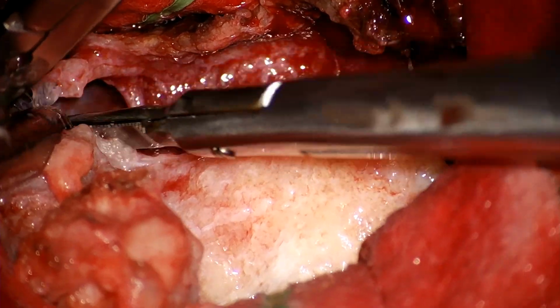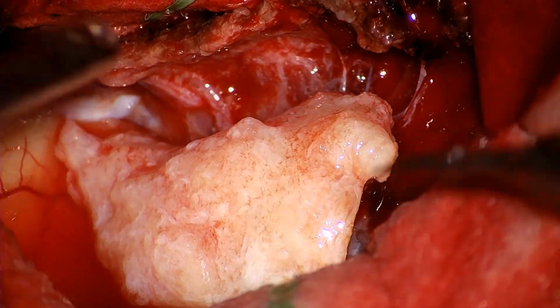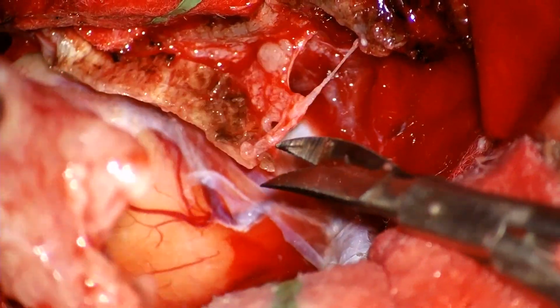And now, to avoid working with the assistant in such a narrow corridor, I can apply traction to the tumor by sucking on it with my suction tip. And finally, we complete the sharp dissection of the Sylvian vein.